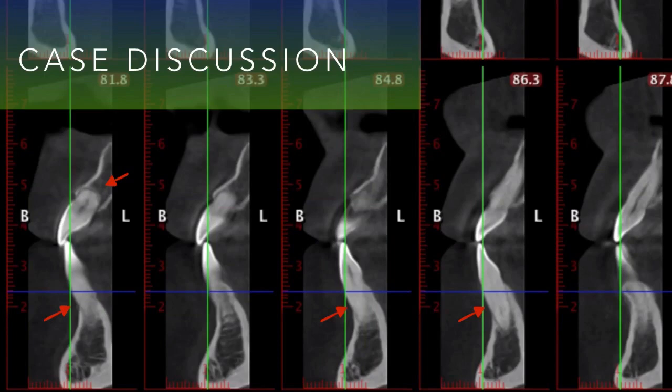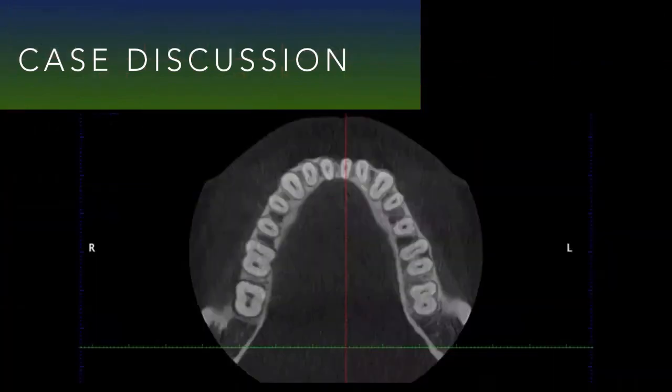So before starting treatment on any adult, I always make sure that they have periodontal clearance from their dentist or periodontist. And so this patient clearly shows up. I request that periodontal clearance and then send her to the periodontist to say, hey, do we have clearance to treat her case? And the periodontist sends me a message back and says, oh, yeah, you're fine. I see some recession on adult cases all the time. You should be good.